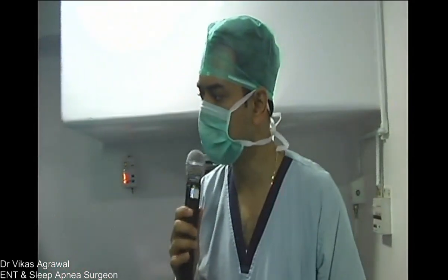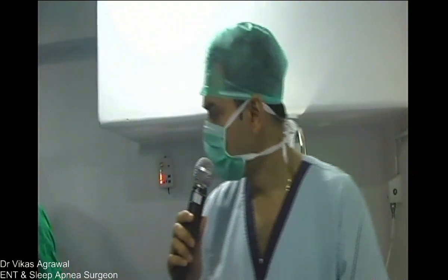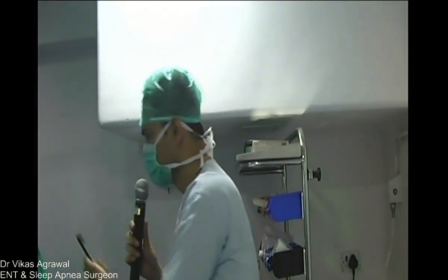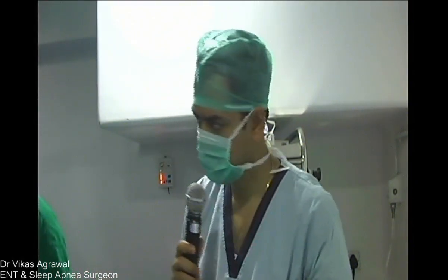Are we ready, Dr. Vikas? No, we have still a few minutes. Okay. So I'm using navigation, right, even for septoplasty, so that I can demonstrate high septal deviation.